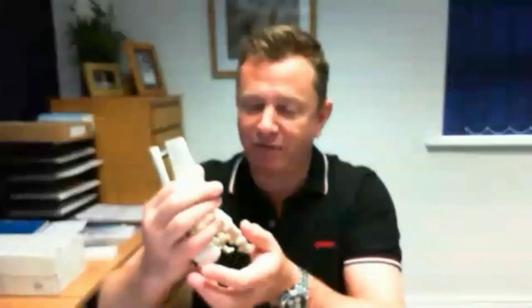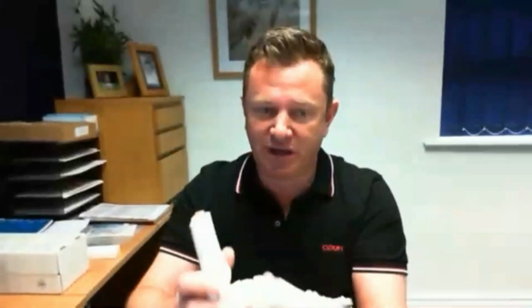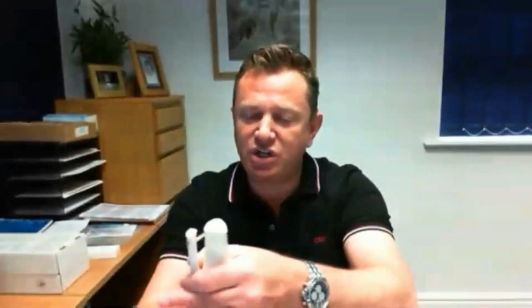Stop them getting to the point where their foot compensates for muscle tightness, but talk about supportive features within the orthosis to ensure that their foot is comfortable and can function. Trying to stop it moving, you can't stop. You can't stop. It's going to move. And the position of the heel is there.